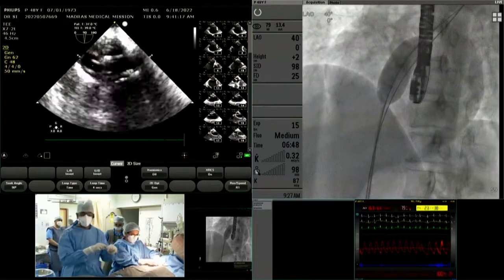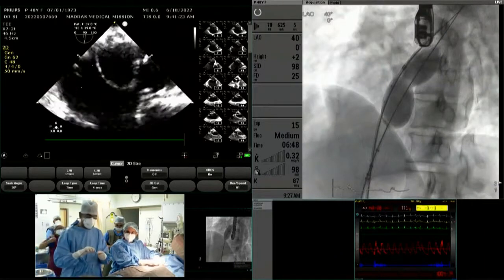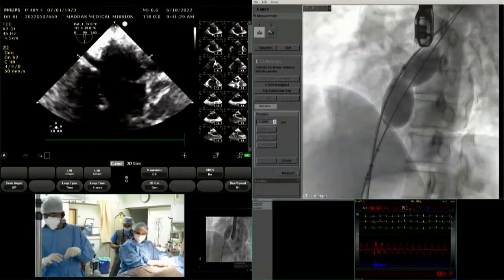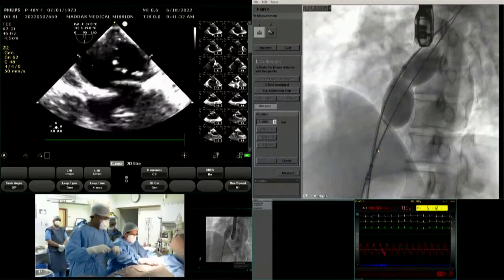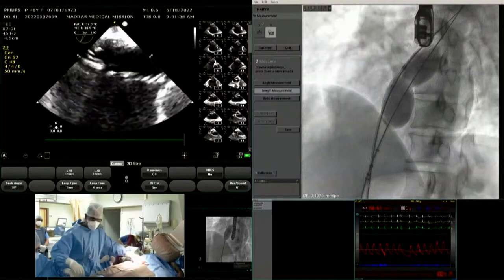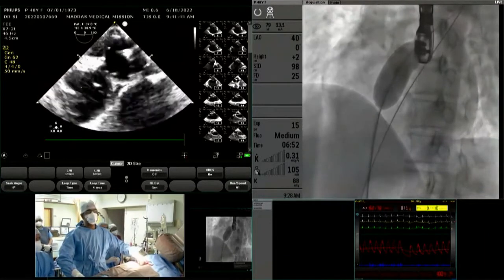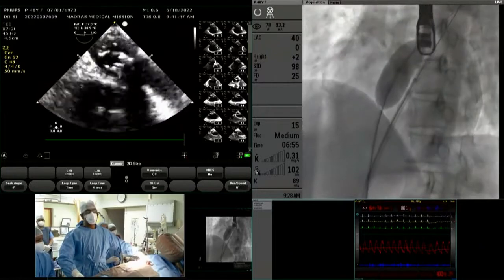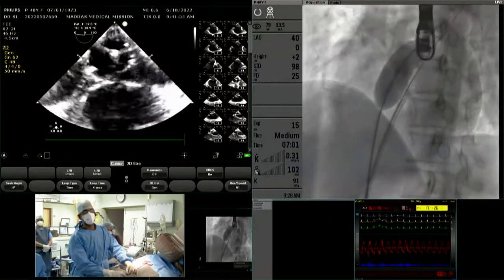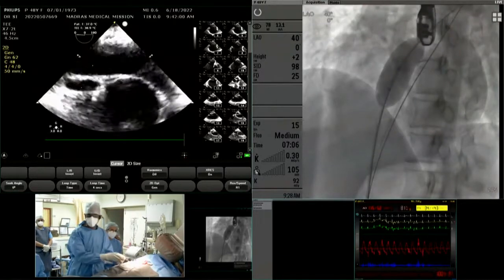The first and second purpose of the sizing balloons across both the defects is to avoid the second crossing as well as assess the floppiness of the septum after inflating both. The third purpose is to exclude a third ASD. Pramod has written an article in the APC on experience in closing secundum ASDs using multiple devices in about 25 patients, of whom 7 were pediatric and 18 were adults. There are two paragraphs that he has dedicated to balloon interrogation, where he describes the rationale of balloon interrogation.